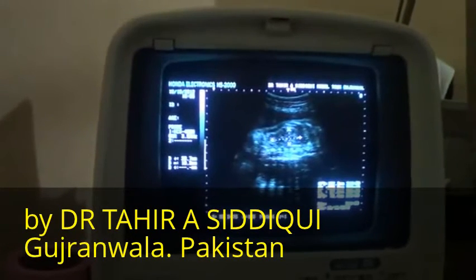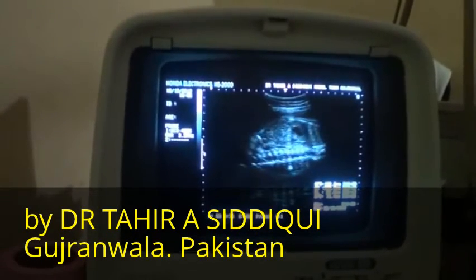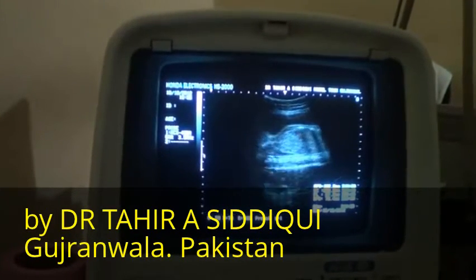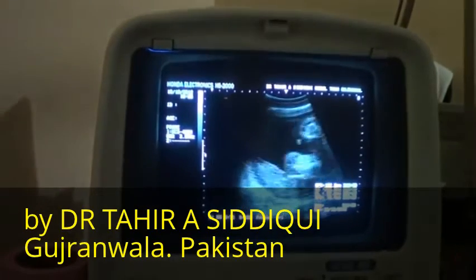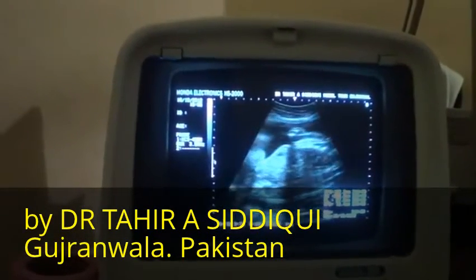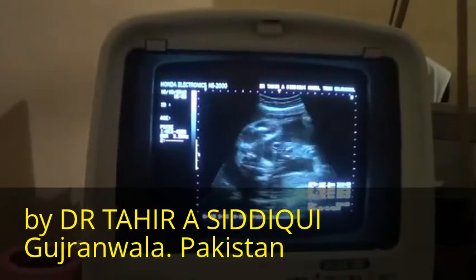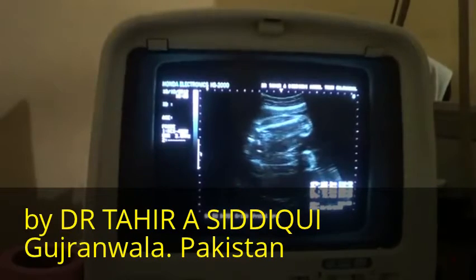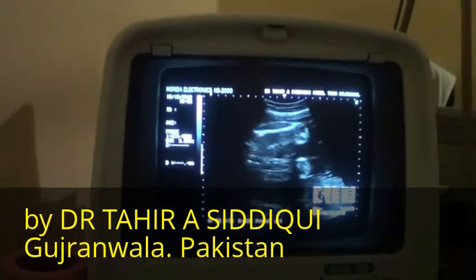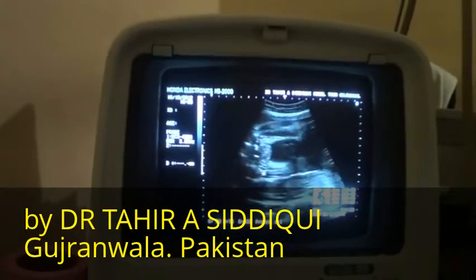The kidney is normal. This is the spinal cord that you are seeing, and let's see if there is any anomaly relating to the limbs. Now this is the femur, and this is the femur.